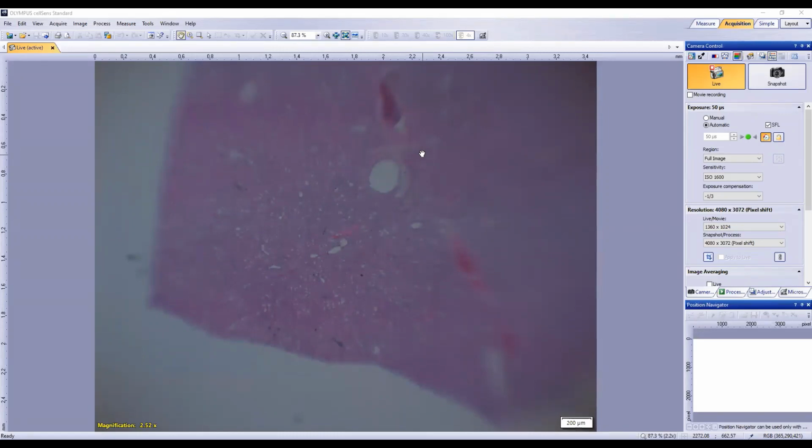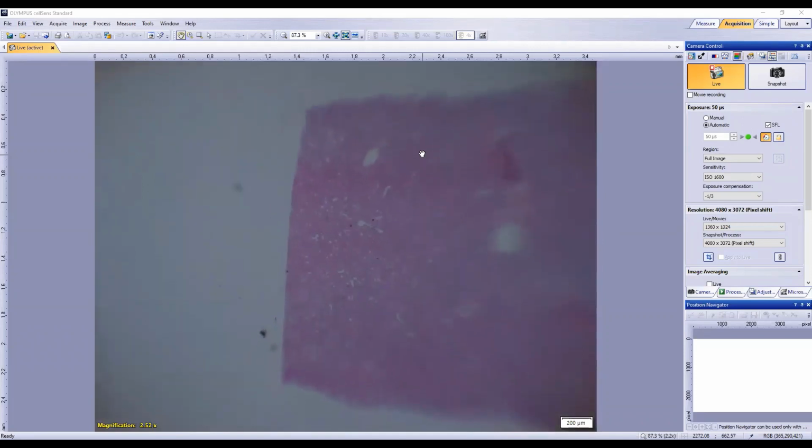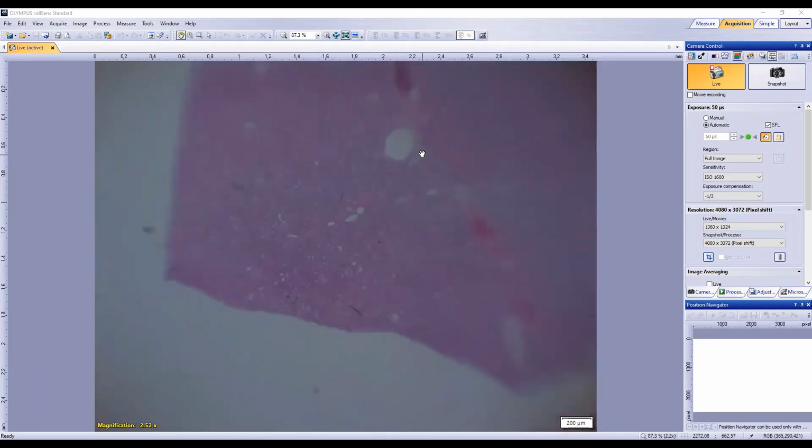Yeah, Sahar, alveoli are filled with exudate, such as purulent material, because of the consolidation and things like that. So these are specific things we're going to be looking for. Now, the other thing that I was looking for at this power, and it's something with lung, liver, kidney that I have to make a deliberate mental note of to go and check, otherwise I tend to forget it unless there's something really florid going on with it. Any guess? The pleura. Yes, exactly.